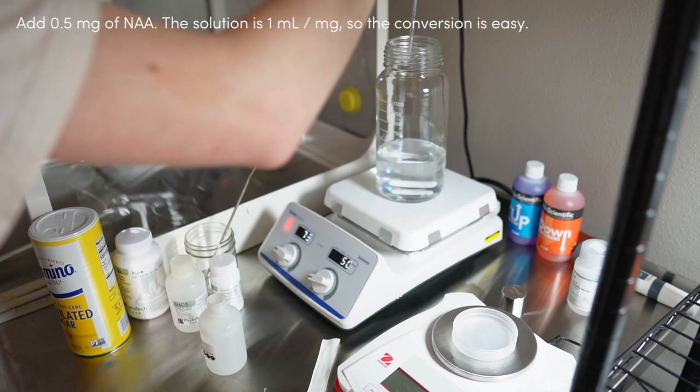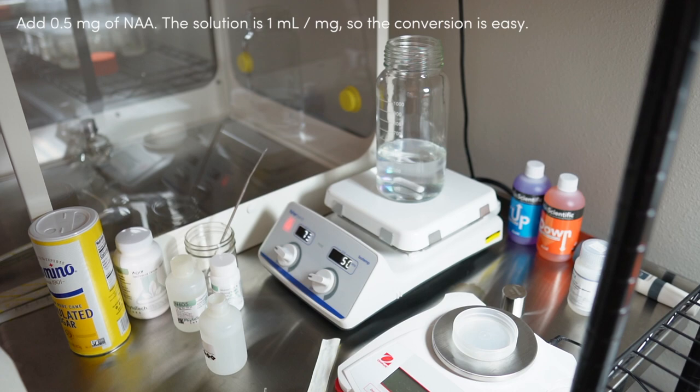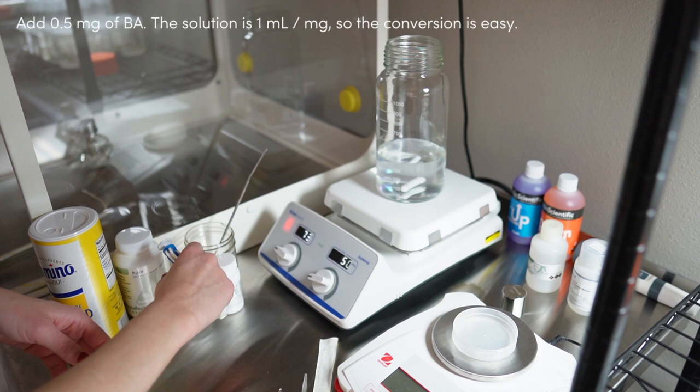Right now I'm adding half a milligram of NAA, and NAA is an auxin, so that will help with rooting. And then I also add half a milligram of BA.